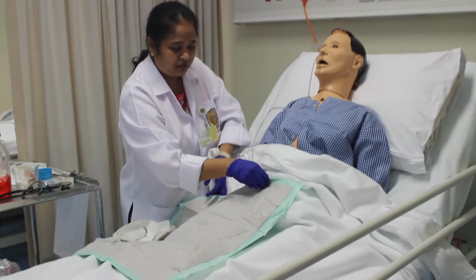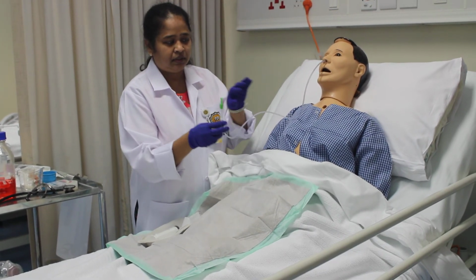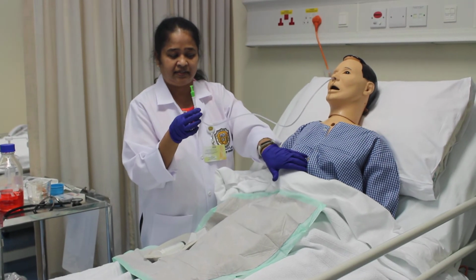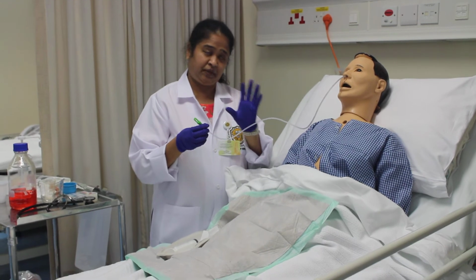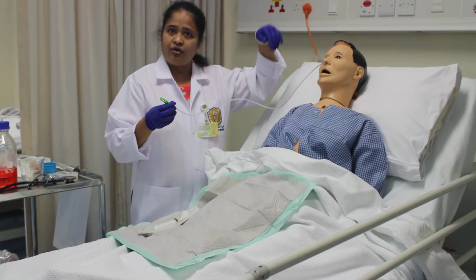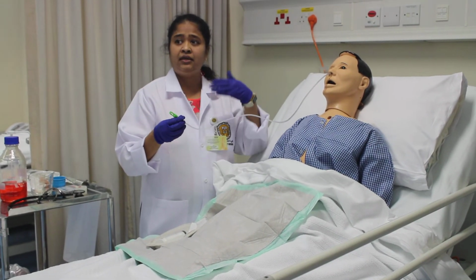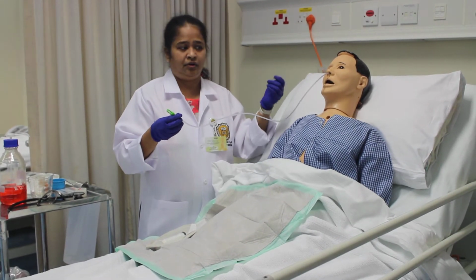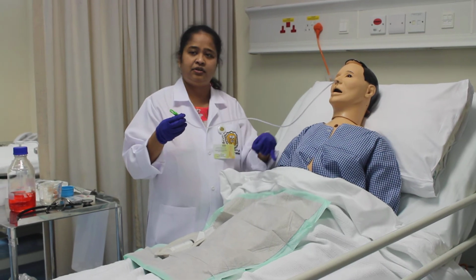Now we are going to do a few checks. How do we know that this gastric tube is there in the stomach? There are a few ways of identifying it. The first one is when you are inserting itself. If it had gone into the lungs, then the patient will be coughing and sneezing and gagging, and he will not allow you to insert it at all. Now our patient is comfortable. So this is the first indication that it has gone into the stomach.